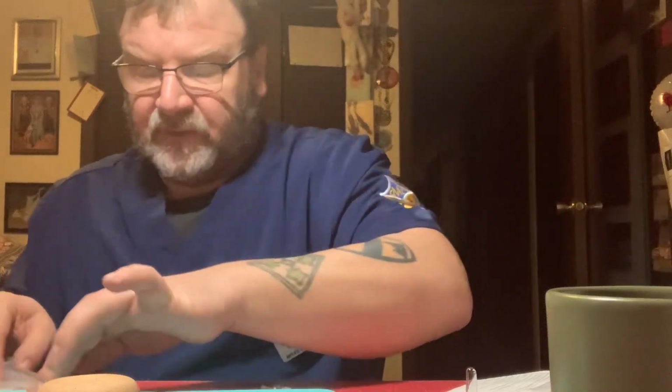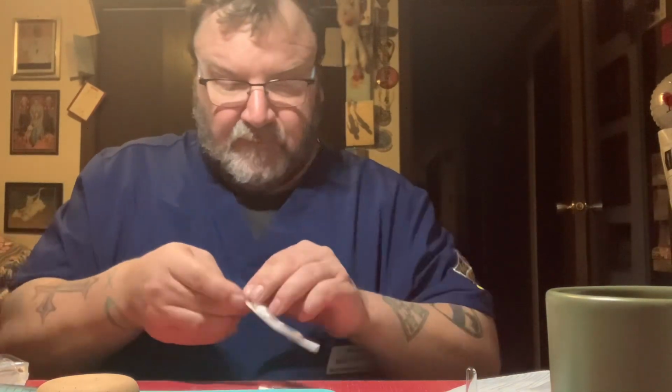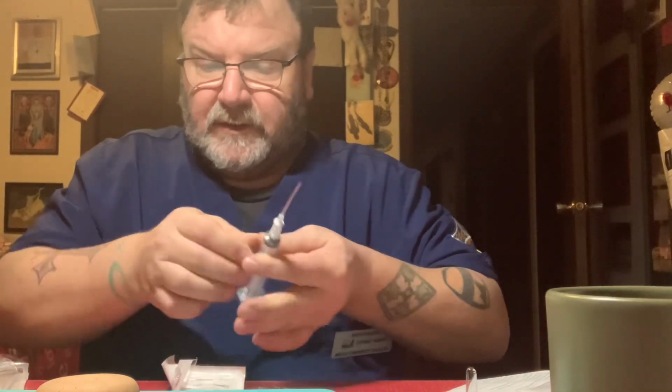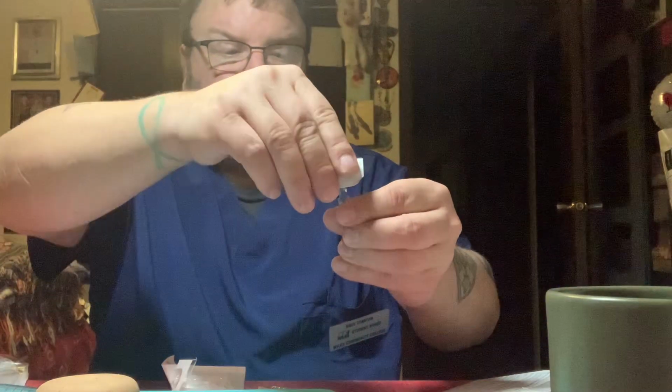So I've got my syringe. I'll make sure that my surface is clean. Then I'm going to set this, and I'm not touching anything but the barrel. I'll remove my filter now, and doing the same thing. Okay, I'm going to attach that filter to my syringe. Great. Now I will need to open this away from me.